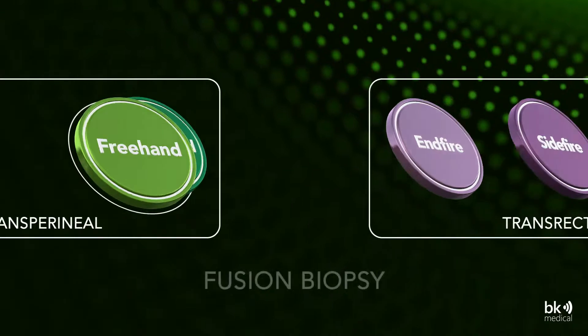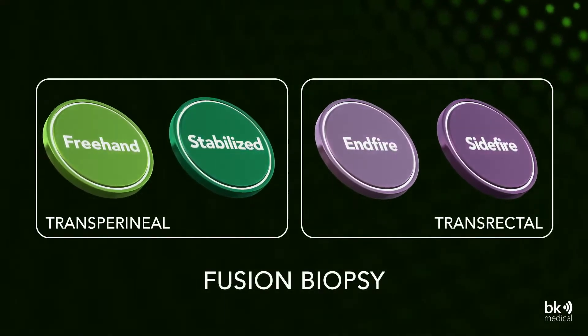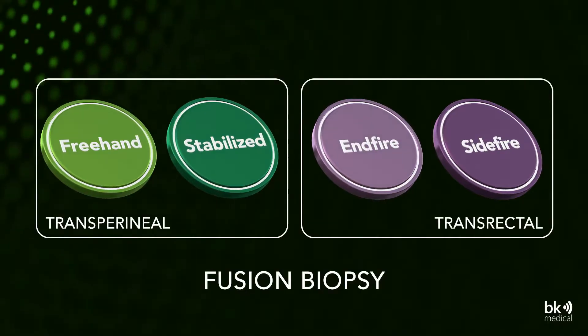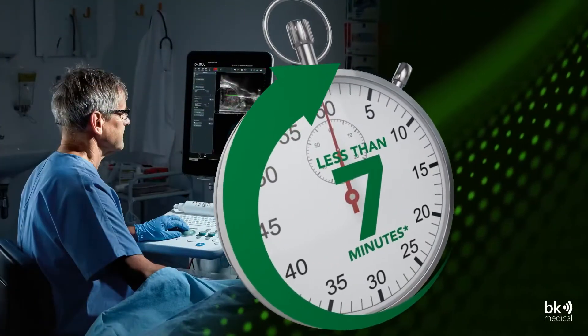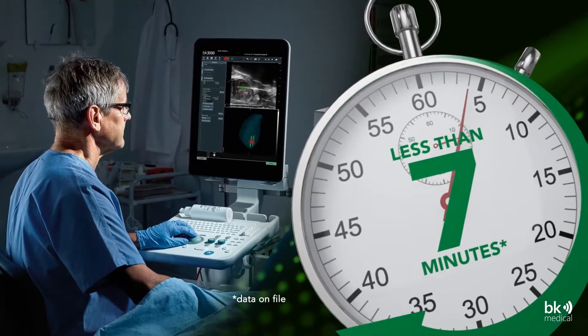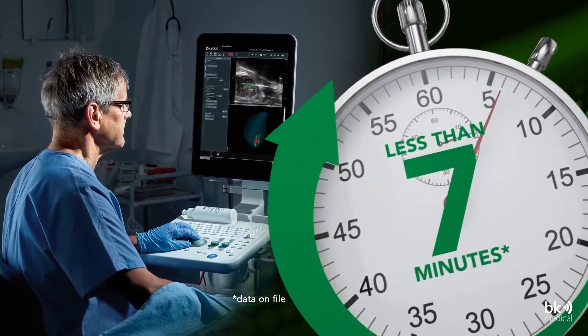TP biopsies have a reduced risk of infection, and the BK Fusion portfolio now includes a TP freehand option. Doing a prostate biopsy with BK Fusion TP takes less than seven minutes, and the TP approach can be done with local anesthesia in an office setting.